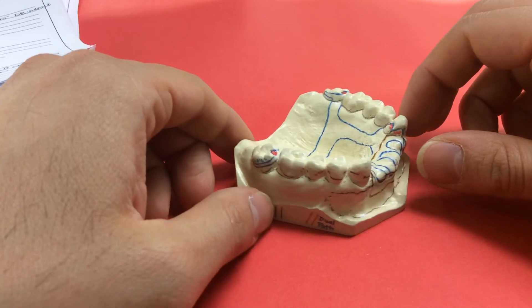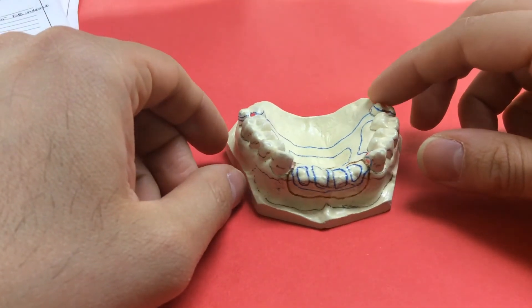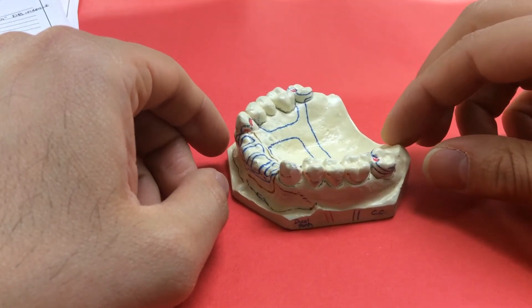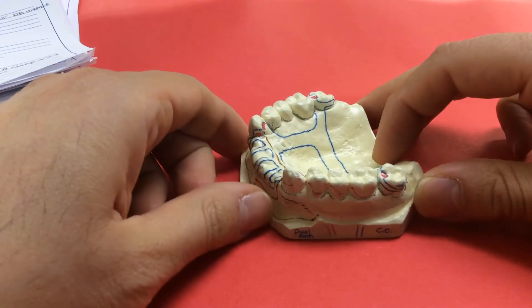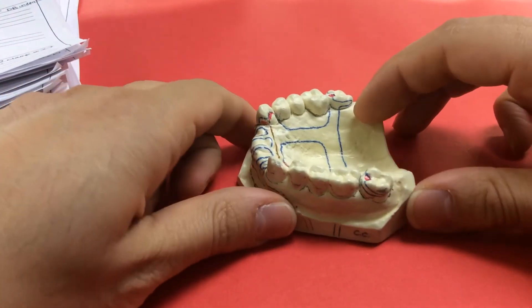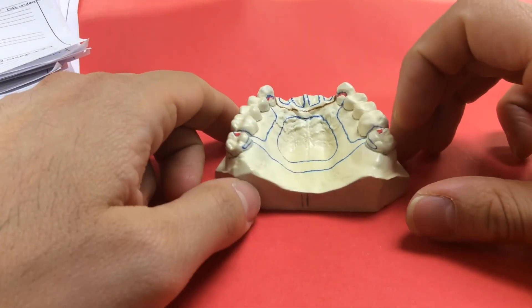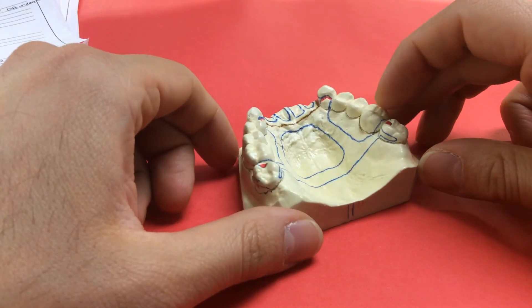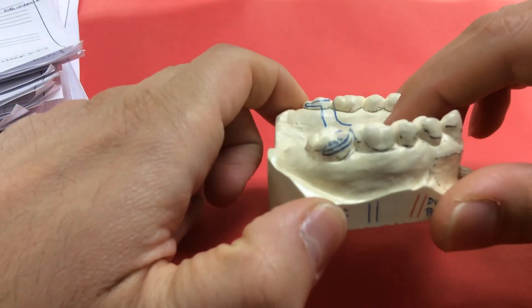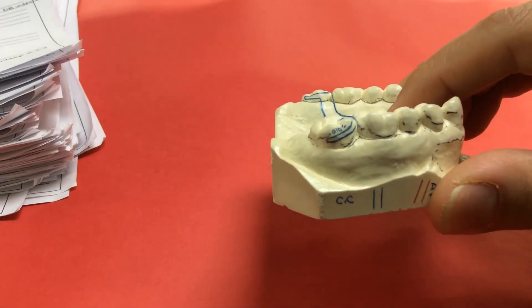The design for cast number nine is already drawn for you in your manual, and you'll draw that design on your cast. The second cast will be used to make a custom tray, which you'll bring back to the mannequin a week or so from now to make a master cast impression. Tomorrow you'll make three alginate impressions, pour three casts, and mount the upper cast onto the articulator.